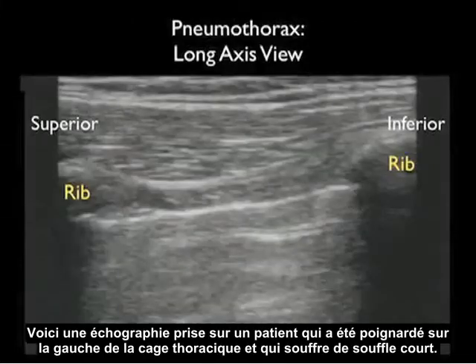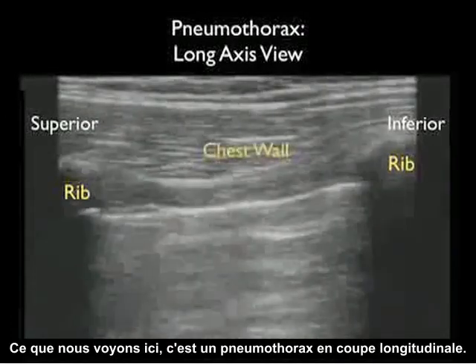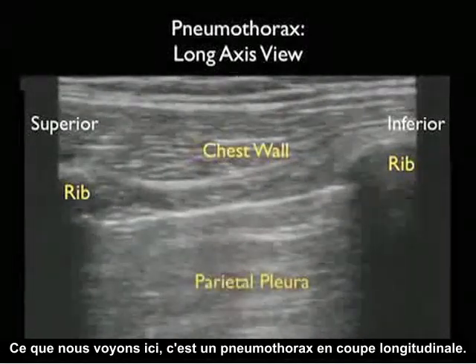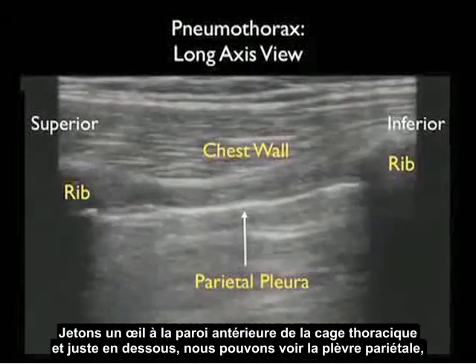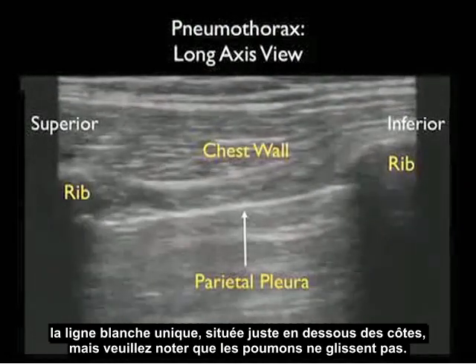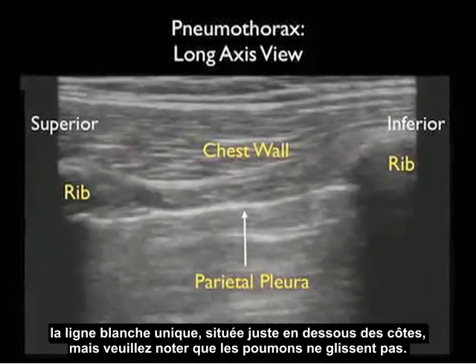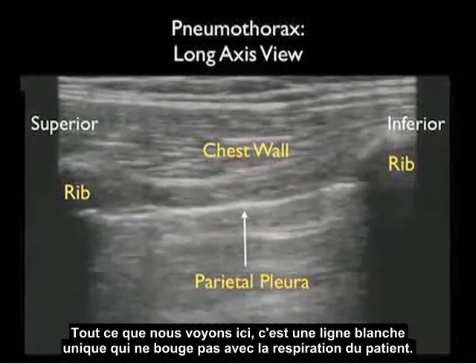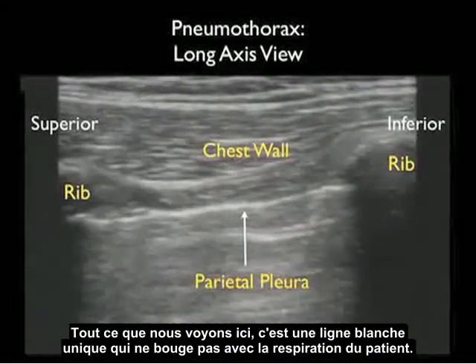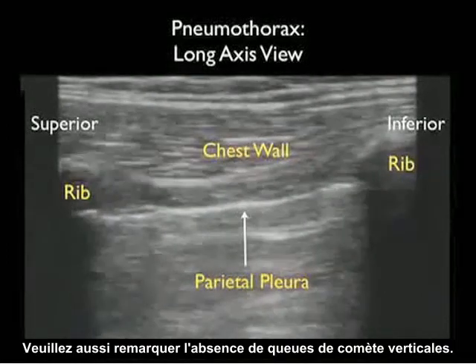Here's an ultrasound image from a patient who was stabbed to the left chest and had shortness of breath. This is a long axis view of a pneumothorax. We see the chest wall anteriorly, and right below that the parietal pleura — a single white line located directly inferior to the ribs — but notice the classic lack of lung sliding. All we see is a single white line that fails to slide back and forth as the patient breathes. Notice also the absence of the vertical comet tails.